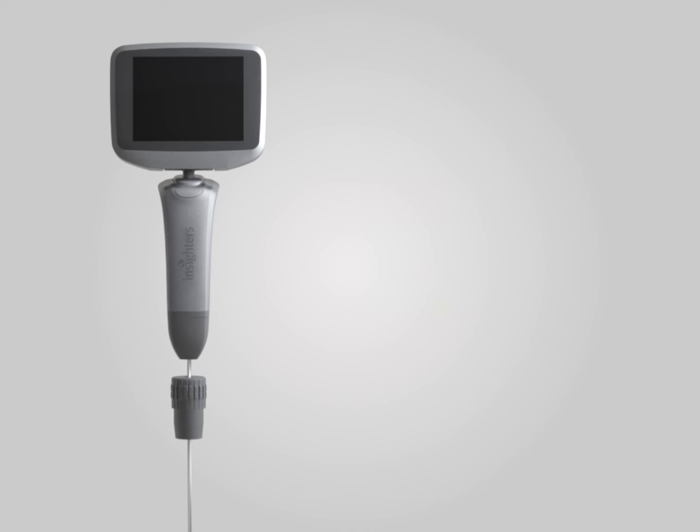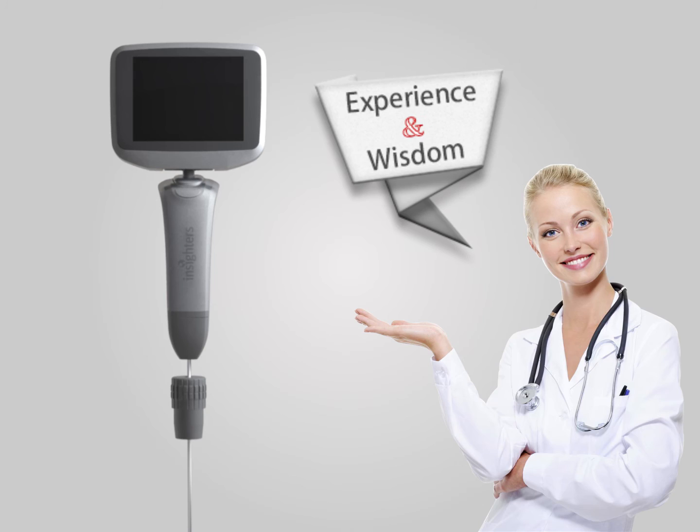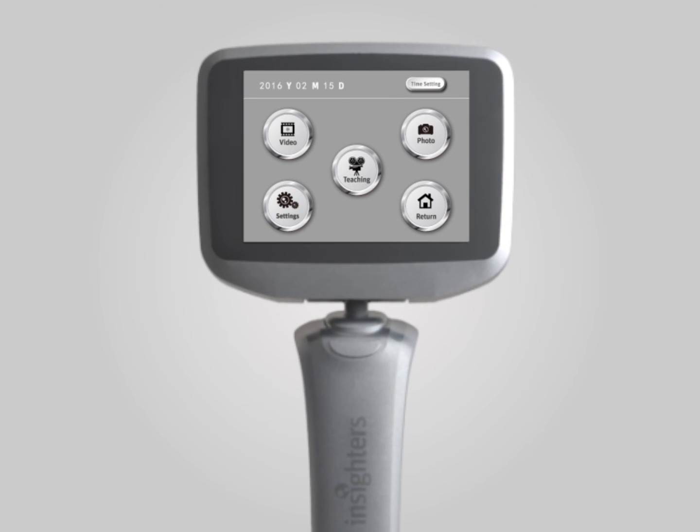Meanwhile, the experience and wisdom of your esteemed doctors are most precious. Inside-3 is equipped with a multimedia sharing function. You can record cases by photograph or video conveniently for teaching, academic communicating, and sharing with others.